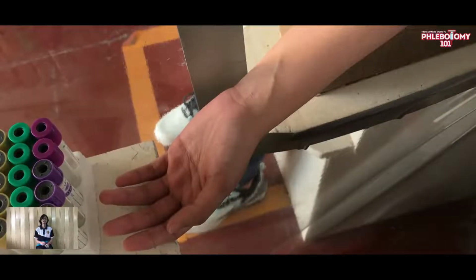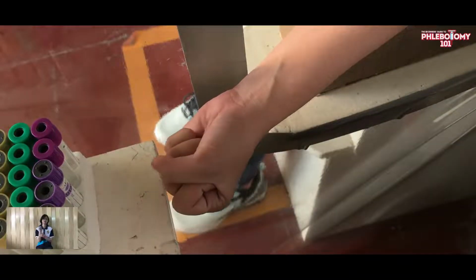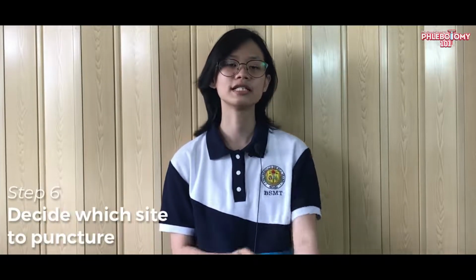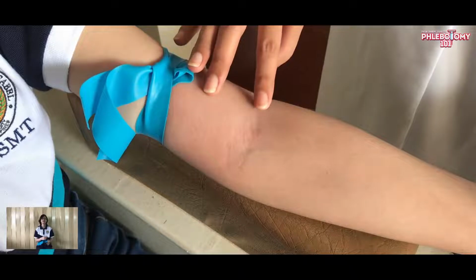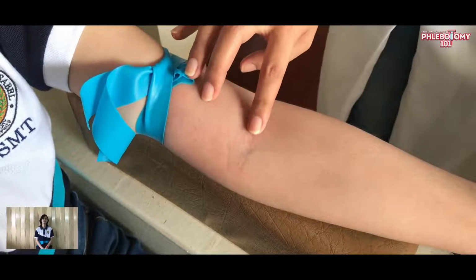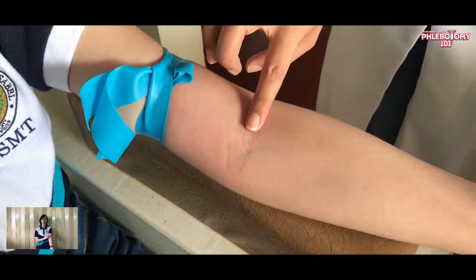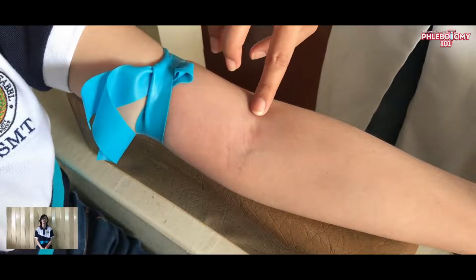Kapag nailagay ng tourniquet, ask the patient to clench their fist. For step 6, decide which site to puncture. Ang preferred venipuncture site is the antecubital area of the arm. Next, gauge the size of the vein by rolling your fingers side by side and gently press on the site to check its depth and patency. Pagkatapos nito, alisin ang tourniquet and ask the patient to open their fist.